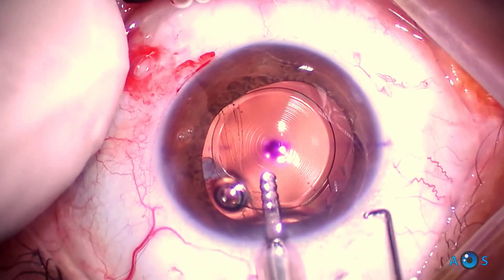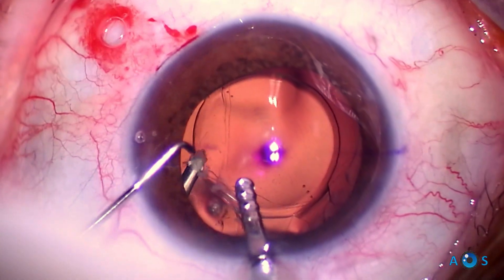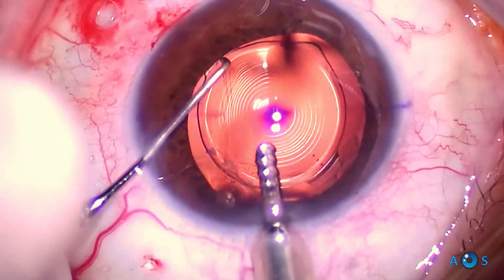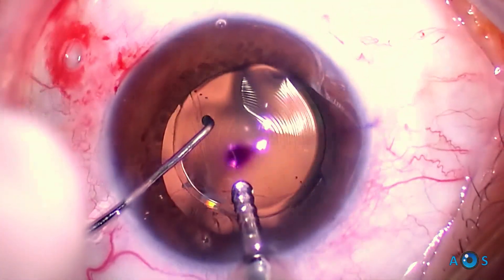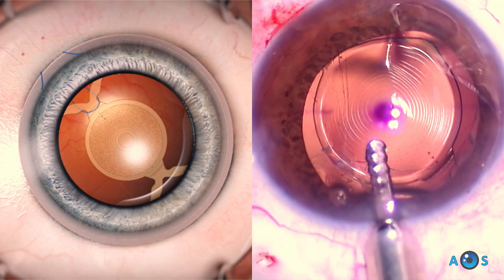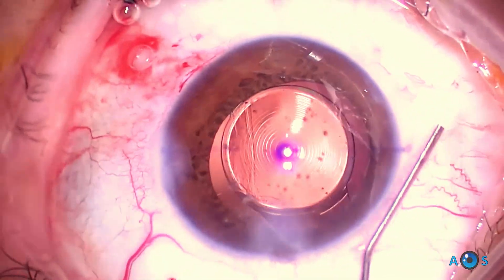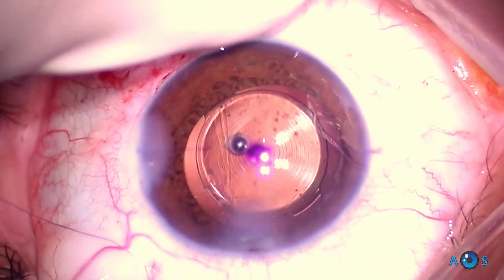At the third knot, decentration movement is minimal and chopper maneuvers at the IOL are now more resilient. A final fourth knot gives additional resistance to the suture. The last balance of forces between the knot strength and the chopper maneuver is critical for ultimate IOL centration.